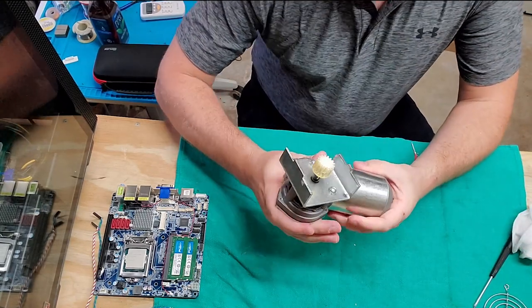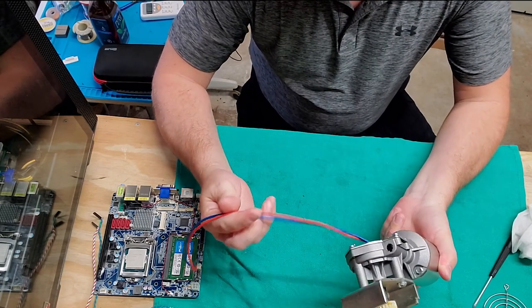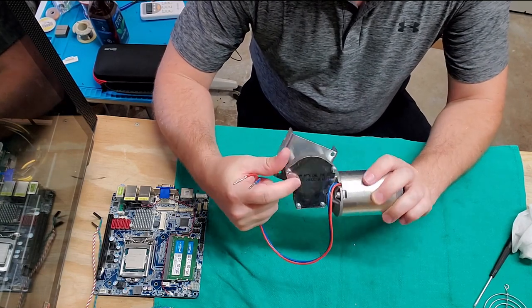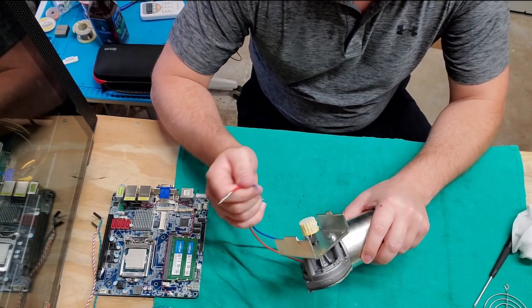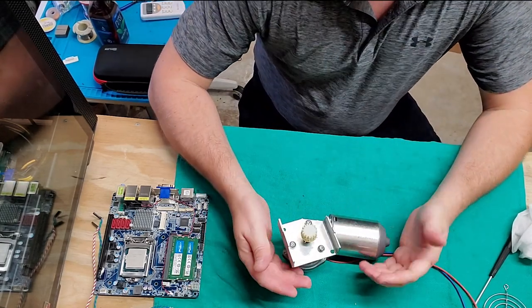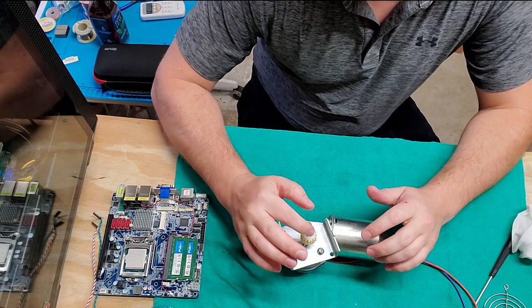Let's check out this motor. Look at this guy. This is just a regular motor, and it says 24 volt DC. Very simple. It's got a gear reduction right here, and a transmission that comes to an output shaft, which has a nylon gear. Very simple, but the duty cycle on these is really low anyway, and like I said, the weak point is designed to be the nylon gear.